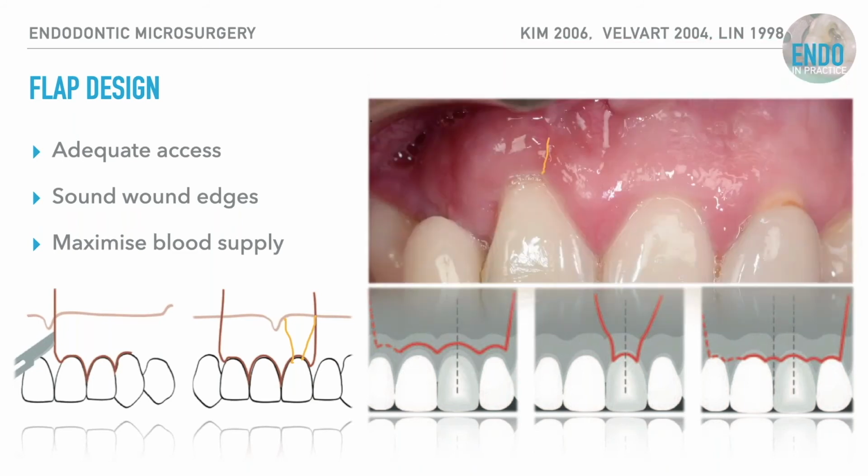If you design your incision right at the biggest bulbosity of the tooth at a very kind of vertical angle, the chances of this necrosing, this little bit necrosing here, and then your approximation of it is very difficult. If you come out at 90 degrees each side and then go up, you've got all these little angles to nicely approximate with, and it's not on the most bulbous aspect of the root convexity. So you've got the minimal chance for recession.